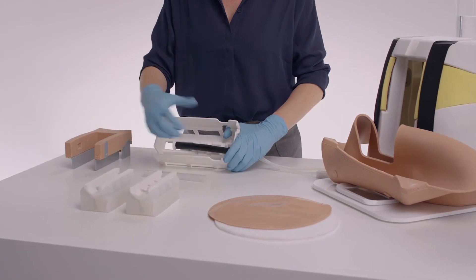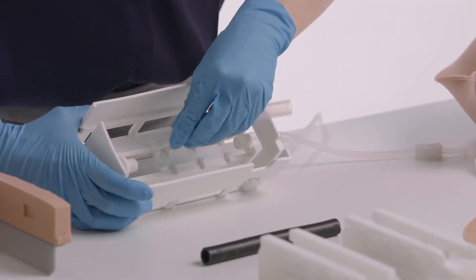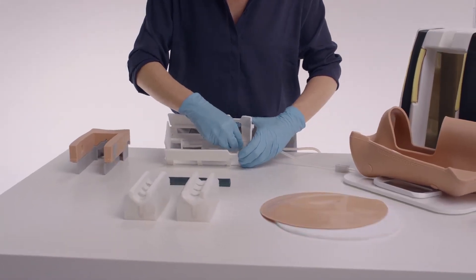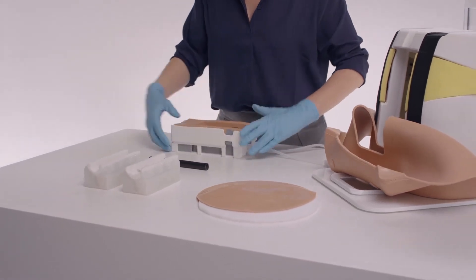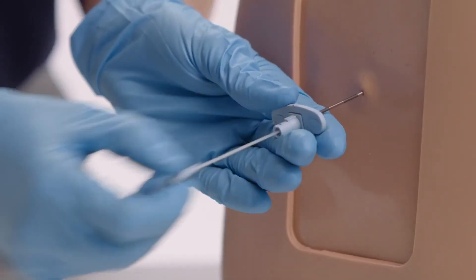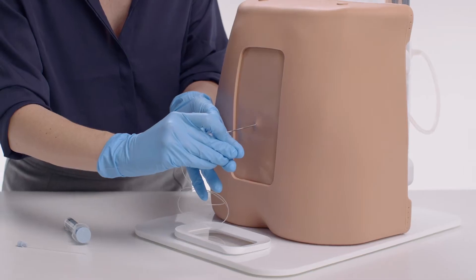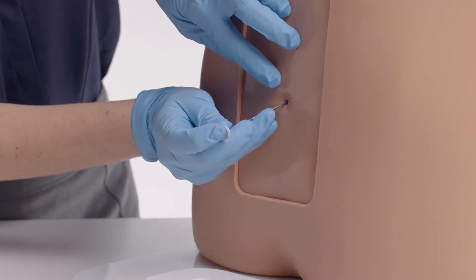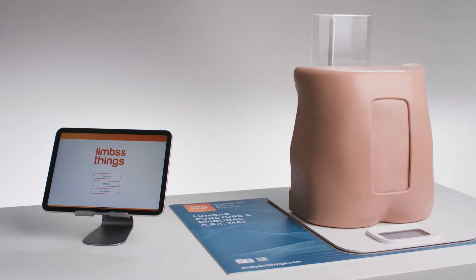Moving to more advanced training needs and closer to life realism, the Advanced Epidural and Lumbar Puncture Model offers skills including spinal anesthesia. The trainer includes optional fat pads, standard duras for repeated practice, advanced duras for a more realistic feel with the potential for trainees to accidentally pop the dura, and standard and advanced epidural inserts. The standard allows practice of the loss-of-resistance technique, threading of an epidural catheter, and admission of fluids, whilst the advanced epidural inserts feature narrower spaces and a steeper spine for more challenging injections.